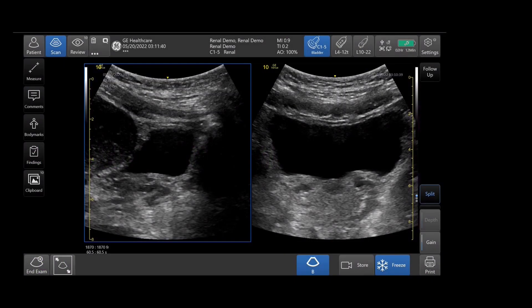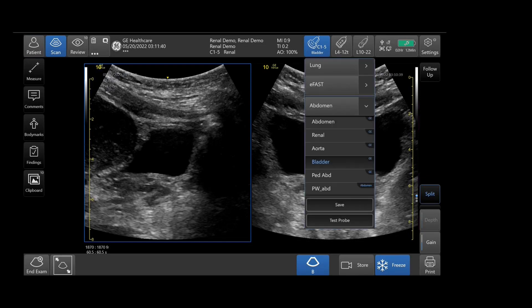Obtaining a bladder volume on the Venue family line is easy and can be completed in a few simple steps. First, we will select the appropriate preset from the preset menu. Here we have chosen bladder.